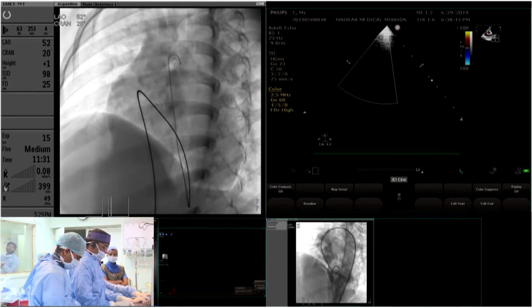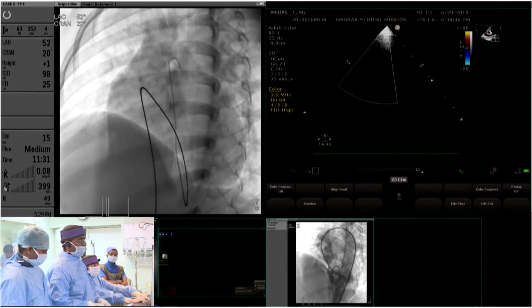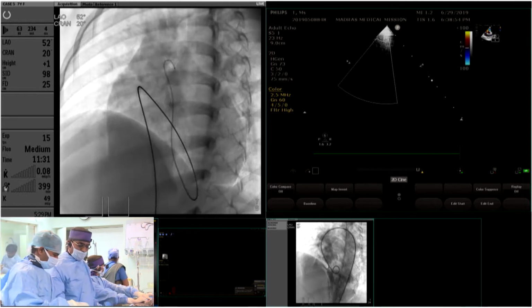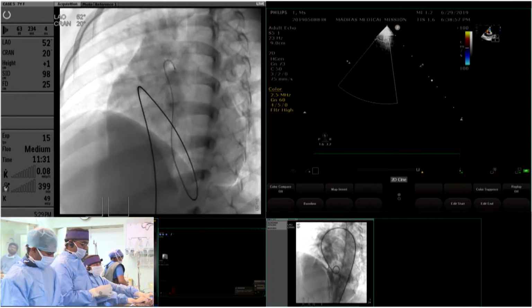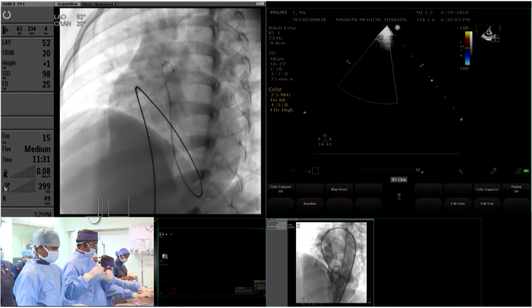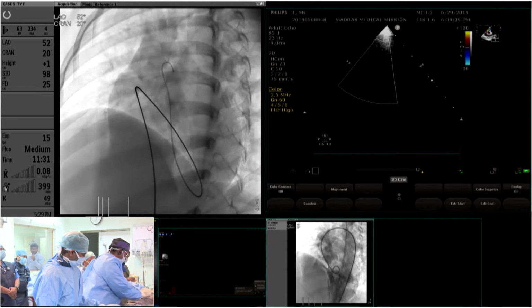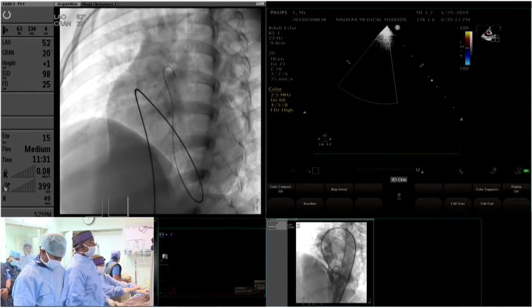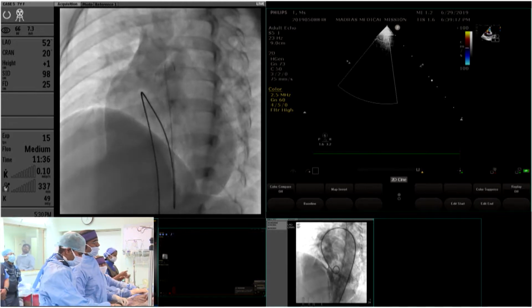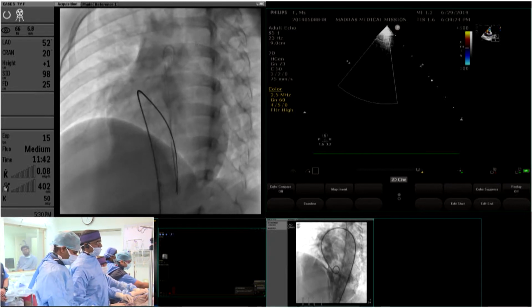Shiva, tell us, do you feel you have enough wire in the aorta to run your device up, or do you feel like this will kick back out? I am actually going to enter into the apex of the left ventricle with my sheath. She's waking up. Just keep her sedated. I think that's correct. You're better off deploying this in the LV rather than the aorta because it might pull through. I'm not sure what sheath you're going to use, but the PDA sheath will turn you into the apex much more easily than a 45-degree sheath. Okay, so right now what I am using is something similar to your PDA sheath.